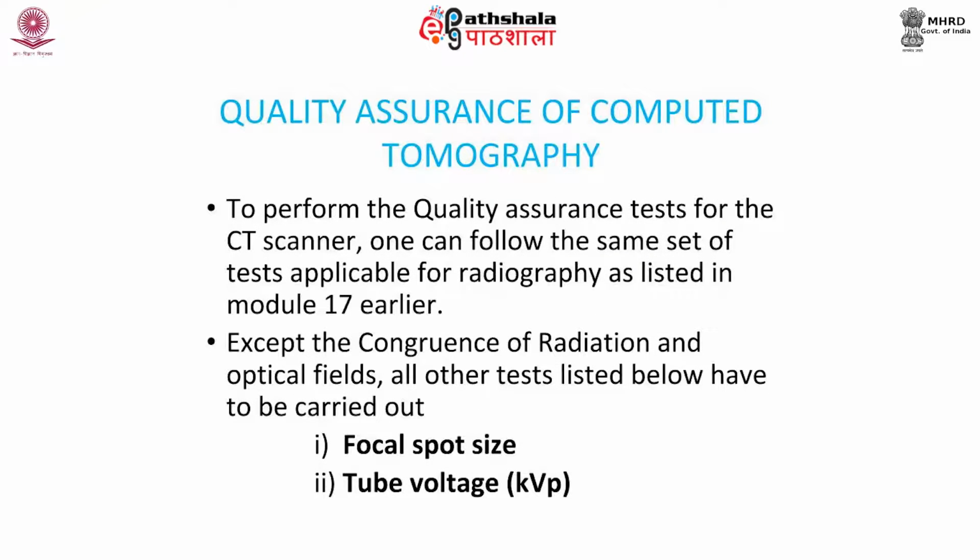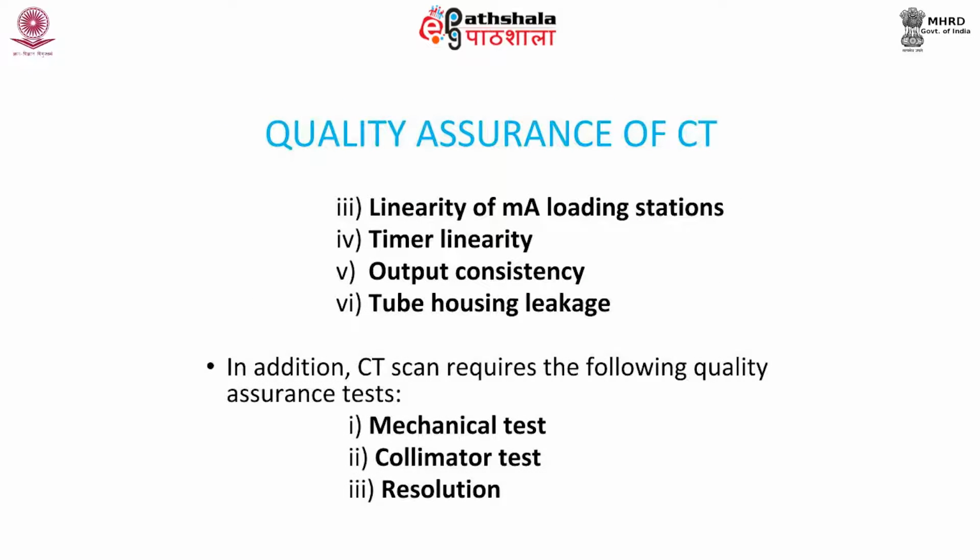Quality assurance of computed tomography. To perform quality assurance tests for the CT scanner, one can follow the radiography quality assurance tests like focal spot size, tube voltage, linearity of mA loading station, timing linearity, output consistency, tube housing leakage. In addition, one has to perform mechanical tests, collimator test, resolution, etc. for the CT scan exclusively.